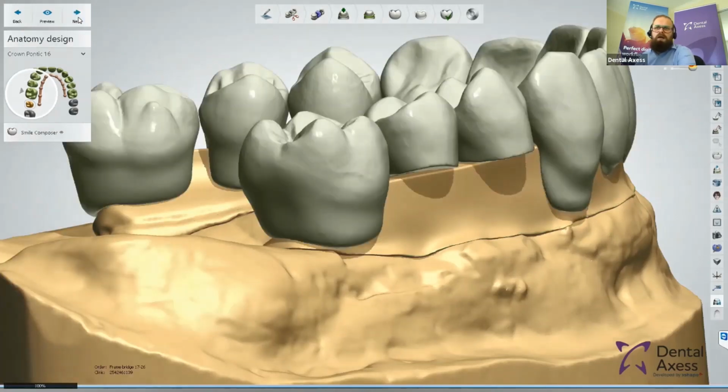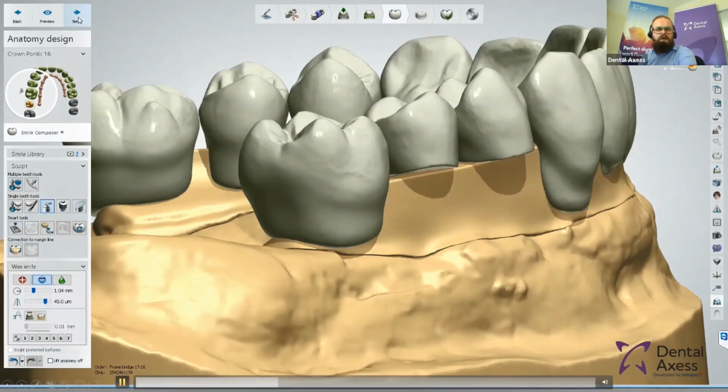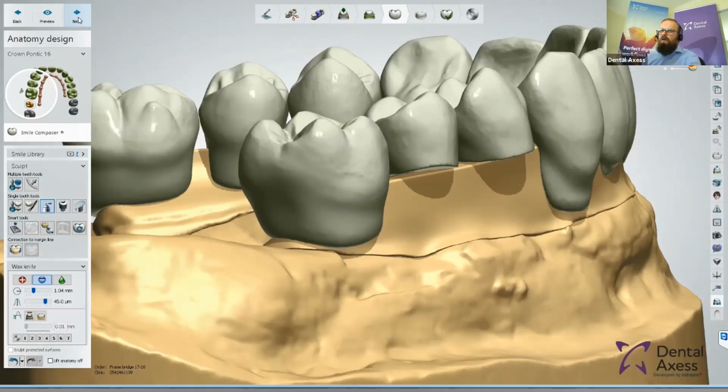And from that point, and this is the good part, when we did the teeth setup initially, you can use an anatomy for reuse, it directly comes in here. So you've got already the right position. And this works really well if you use that function for everything that's crown or bridge work or RPD related. For the dentures, it's different because unfortunately in 3Shape they're using a different library. So you've got the library for normal crown and bridge work, and you've got the library for the denture work. But for the crown and bridge work, this works absolutely beautiful. I'm going to continue in this one.